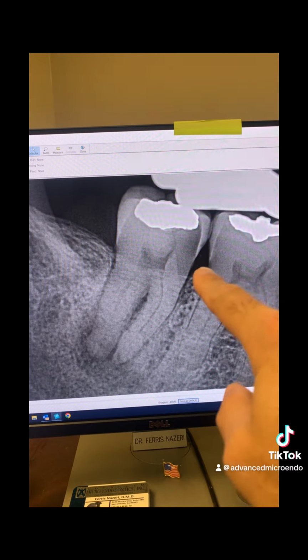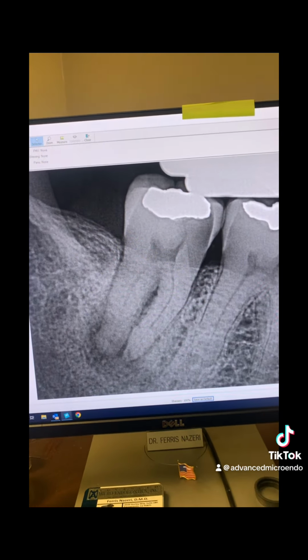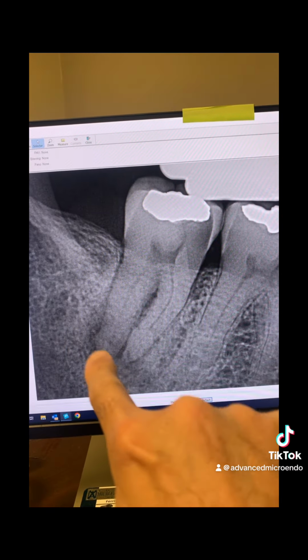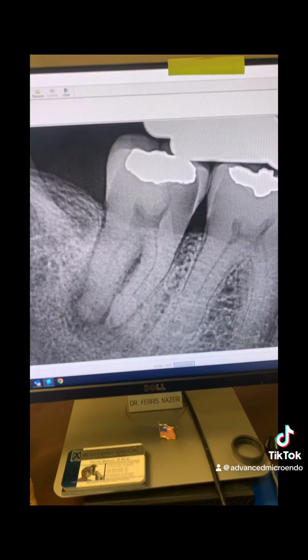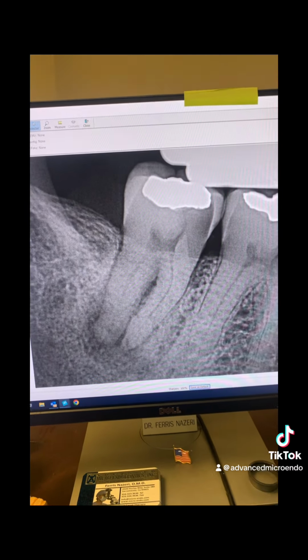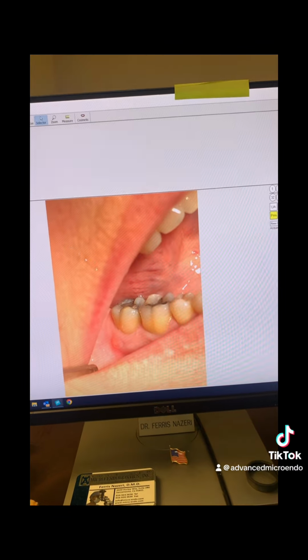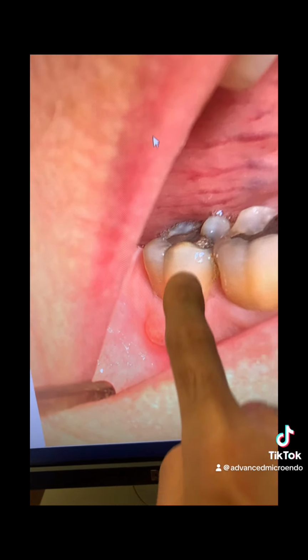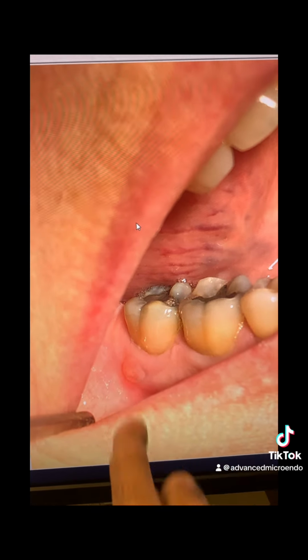And as you can see here, you can see amalgam buildup there. Decay here, MO decay here. You can see a periapical lucency here. You can see some bone loss there. I would have loved to probe that area, but of course I couldn't. And take a look here. And clinically, you can see a sinus tract right there. That's the tooth number 31. And you can see the sinus tract right there.